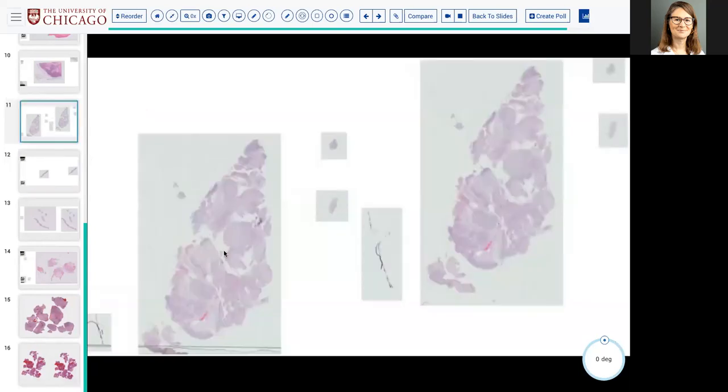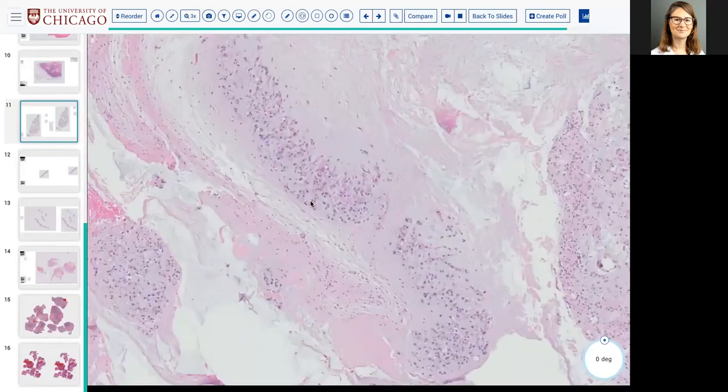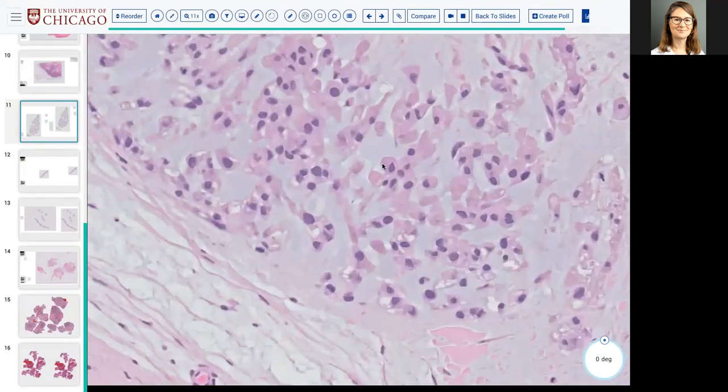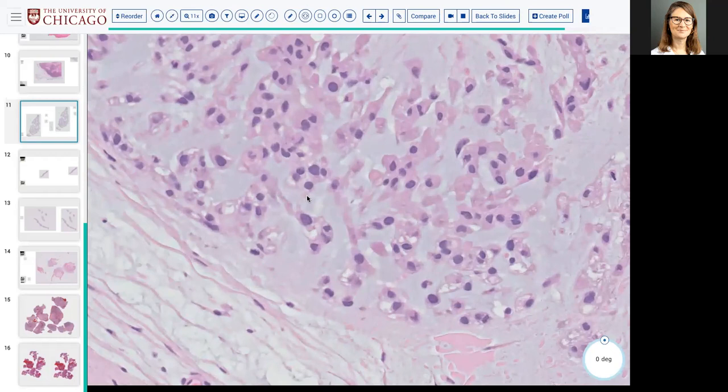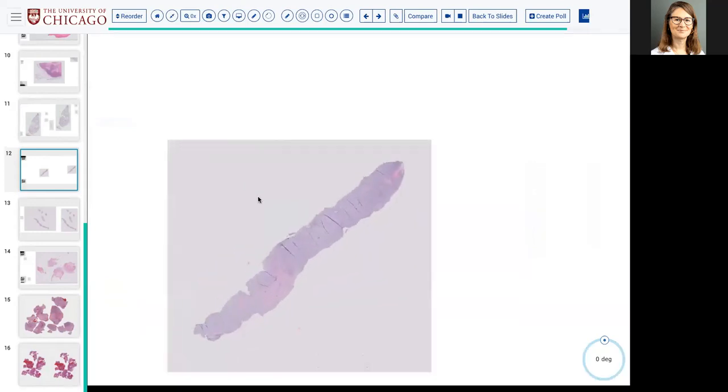So that was a chordoma. The other thing I will mention is chordomas generally have this myxoid background, but they can, in some circumstances, have true cartilage, true chondroid. Those would be the chondroid variant of chordomas. There was some debate in the literature about whether there were any prognostic differences to that, and it's essentially been shown that there are not. So the only prognostic indicator in chordoma is dedifferentiation. Okay, next.